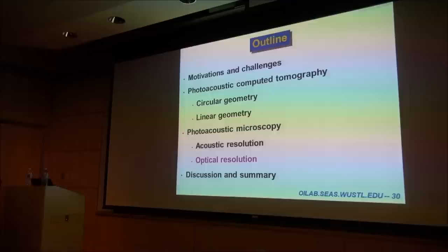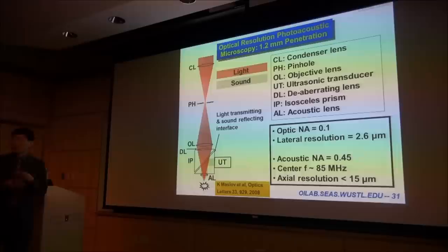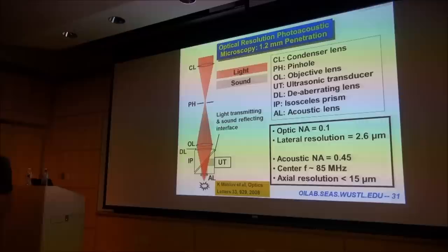We can actually improve the resolution even further, in what we call optical resolution photoacoustic microscopy. In this modality, we're back within the diffusion limit, so our penetration goal is roughly about a millimeter. In fact, our first generation penetrates about 1.2 millimeters. So you're counting on ballistic light, the straight propagating photons, to define your lateral resolution. How well you focus your light determines your XY resolution in a lateral direction.